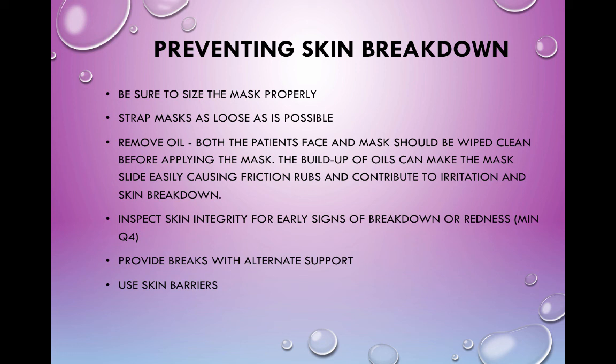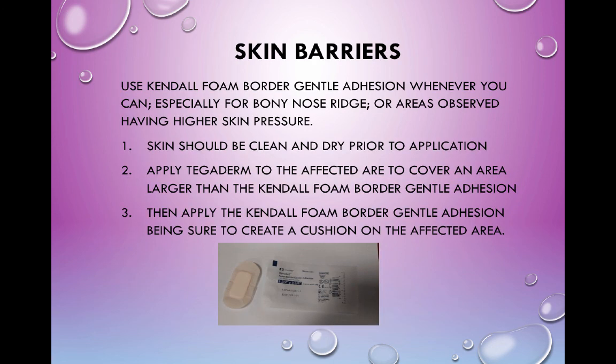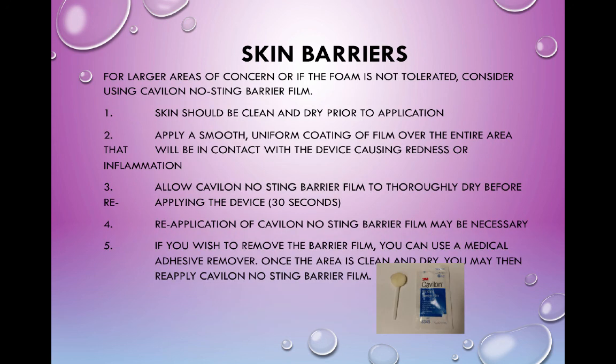And then we have this stuff I call lollipop. This stuff's been around forever. It's good stuff. If you have a spot that you think is suspicious and it's a little bit too big for that little pad, and I kind of prefer this over the other stuff, you put this stuff on there and it really protects the skin well. It's amazing. So you basically put it on, you make sure you let it dry. You just kind of swab it on there. You let it dry. We checked to make sure it's okay near the eyes, and they say it is. But this stuff really is phenomenal.